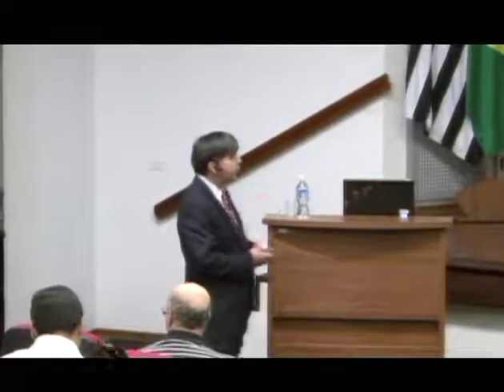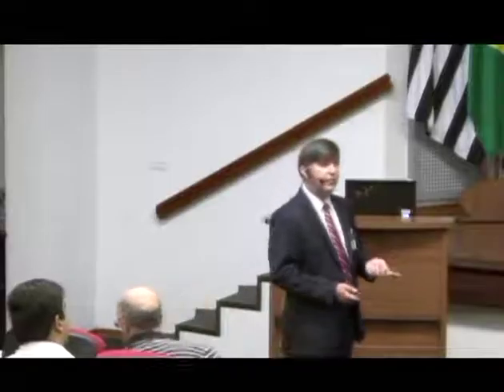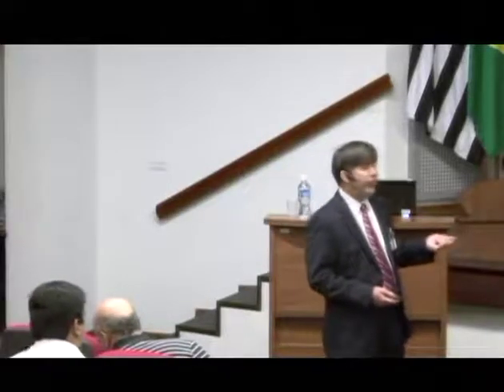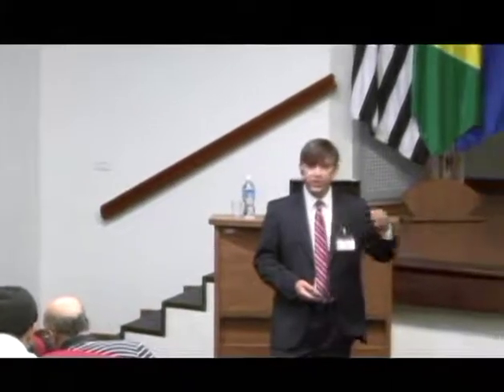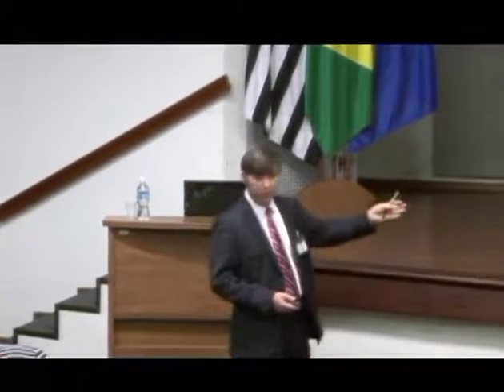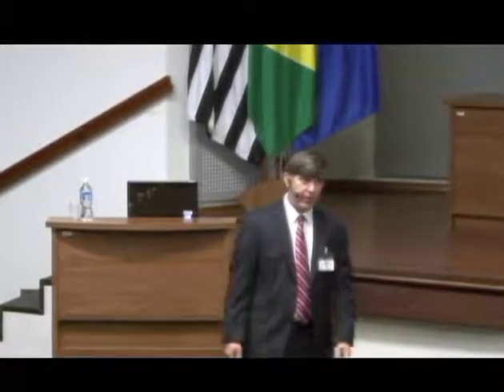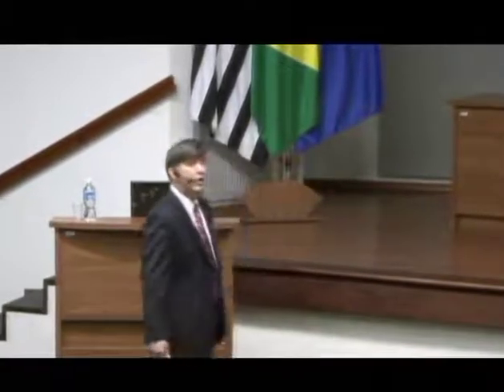But in any particular configuration, you have to have a system that is stable and reliable enough that you can get good, consistent data that will be meaningful over a long time course, because in many cases we're following patients for a long period of time. So they have to be pretty stable over time.